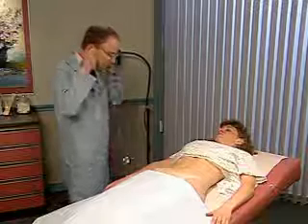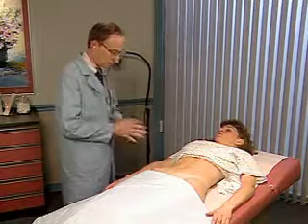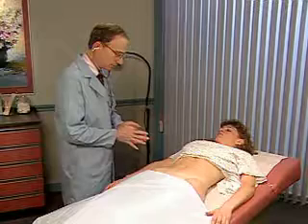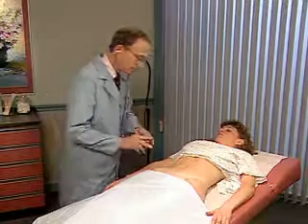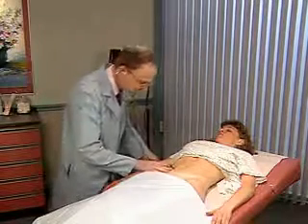Listen for bowel sounds by placing the diaphragm of the stethoscope gently on the right lower quadrant. Listen to their pitch, quality, and frequency.